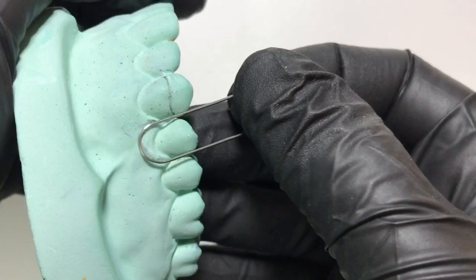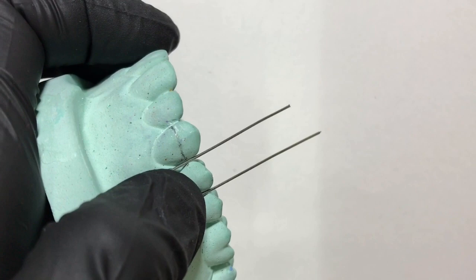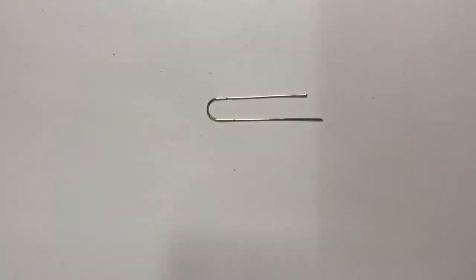This completes our u-loop. It must be symmetrical. We shall check its adaptation on the cast — it should follow the marking. We will then mark two points: one for the retentive arm that will go into the distal embrasure, and one for the active arm that will cover the canine.